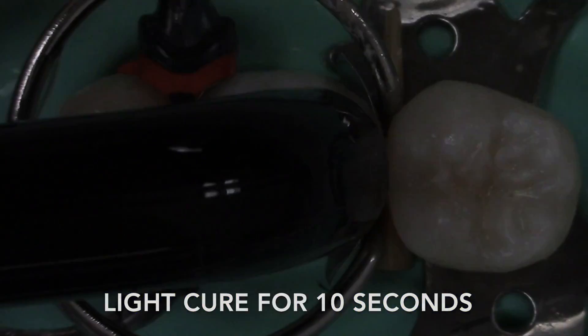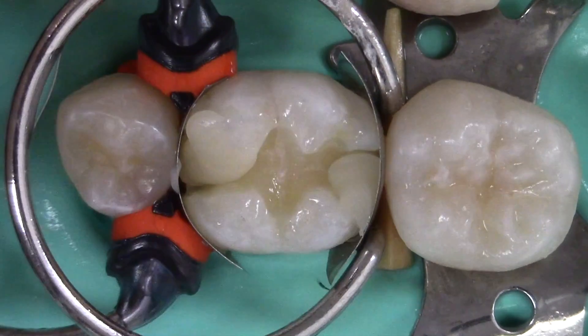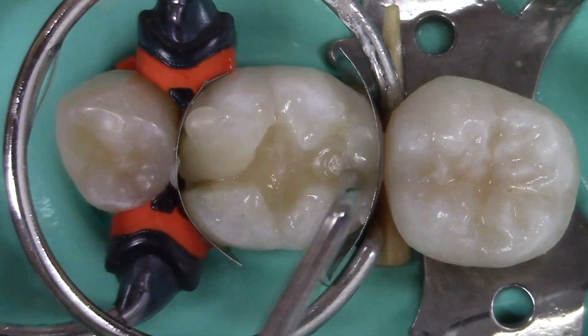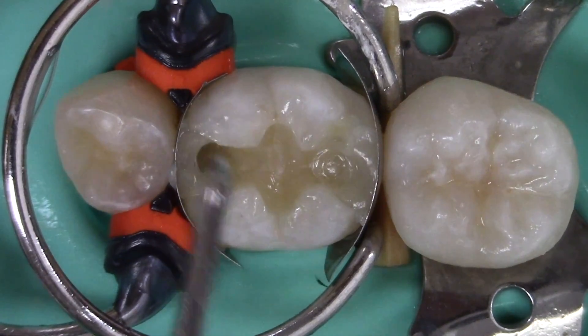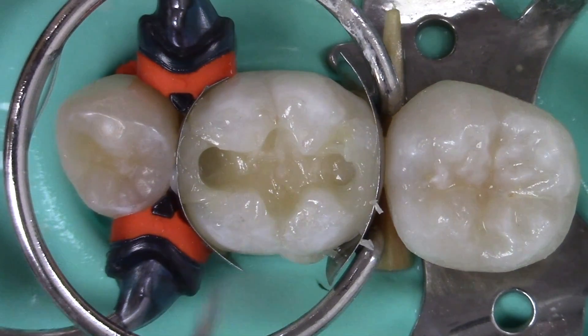We are now ready to fill the preparation. In this technique, the marginal ridges are formed first and then the remainder of the occlusal surface is filled, turning a Class 2 into a Class 1. A small amount of composite is injected or placed into the mesial and distal box. It is important to visualize the placement of this composite and ensure it completely adapts to the bottom of the box. The marginal ridge is formed by condensing the composite to make it even with the neighboring marginal ridges, then the composite is pushed against the matrix, rolling up and forming the marginal ridge. Finally, the ridge is contoured by running an explorer in the area of the occlusal embrasure.